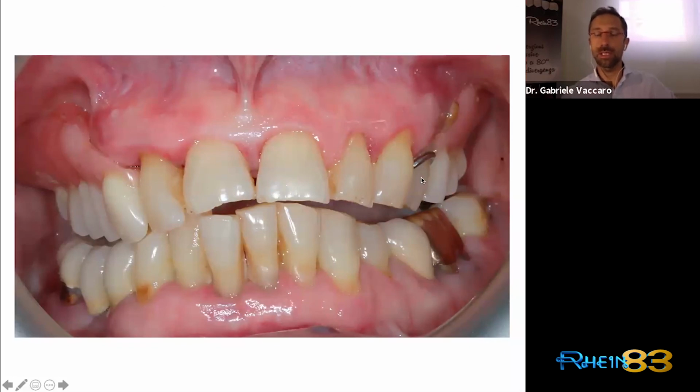So when we have to choose between the clamp and the pivot, we have to be aware also of this, because the clamp can damage the periodontal ligament, and it can be impossible to put an implant in this place. Instead, if we use a pivot inside the root, we can save bone, we can save the bone quality and volume and amount of bone for the next implant.